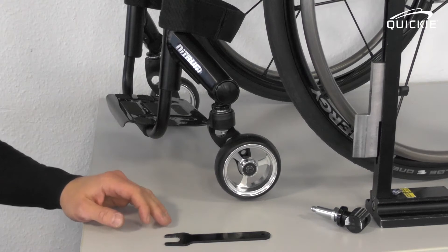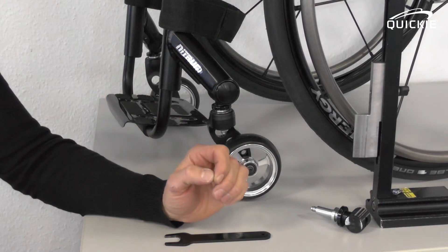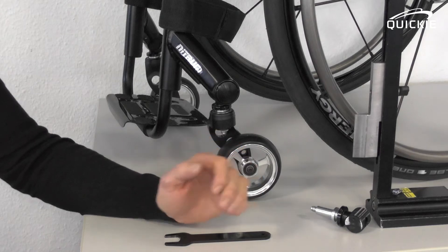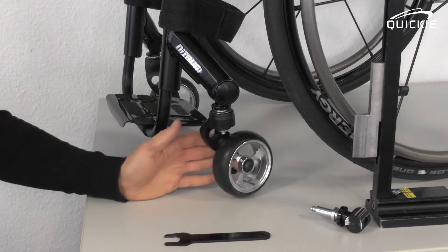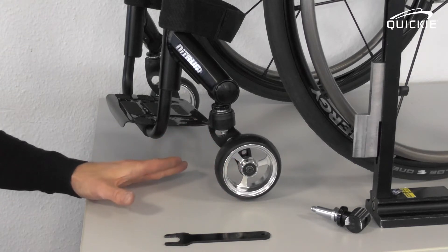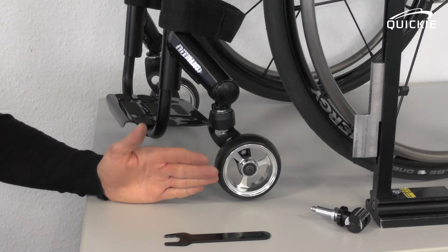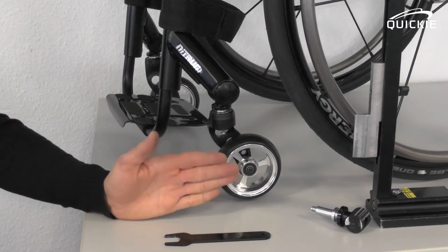Let me show you some of the more advanced adjustments on the Nitrum's caster housing. These procedures are necessary when you either have what we call a floating caster wheel, which means not all four wheels touch the ground, or the chair veers to one side and you want to adjust the straight run of the chair.